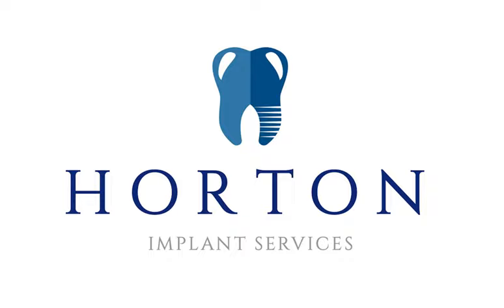And if there's not enough bone to get an implant in there that is stable, this is called primary stability, then we may consider adding a product back. There are various products that we use.